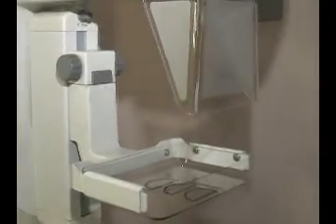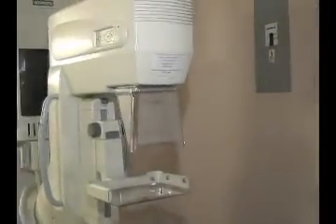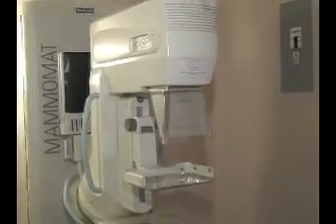So I know that women typically get a baseline exam between 35 and 40. What does that do, and what does that set them up for that this machine will see? The baseline mammogram, like we said, we take 2 pictures of each breast. That's going to be their baseline. Once they hit 40, they're going to come in every year and have another mammogram done. And those mammograms are going to be the baseline to the future mammograms. So it is real important to have them between 35 and 40.